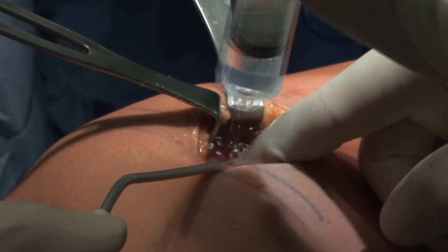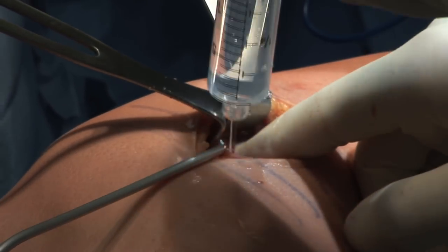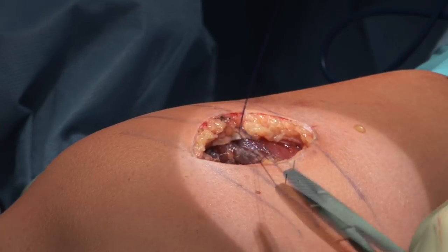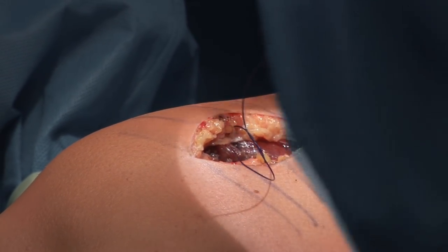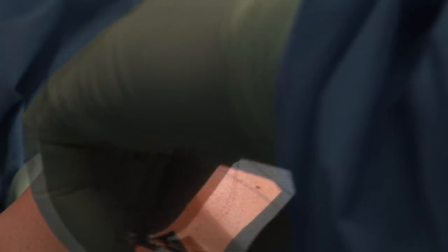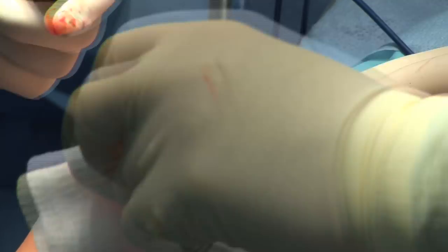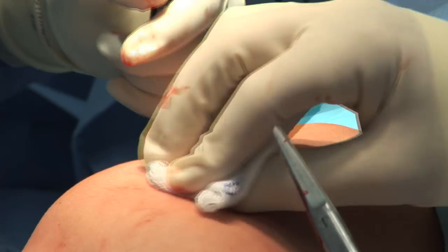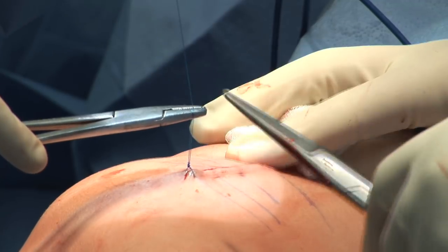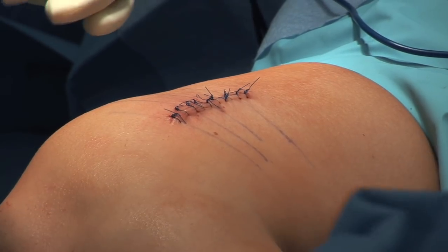Irrigation is performed, and no significant bleeding is encountered during the procedure. Therefore, no drain was necessary. Closure is done with absorbable suture on the fascial layer, followed by absorbable suture on the subdermal layer, and interrupted 4-0 Prolene suture on the skin. A fluff gauze and web roll compression-type dressing is applied.